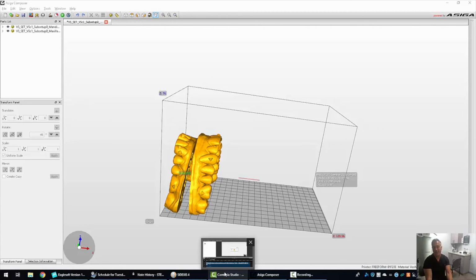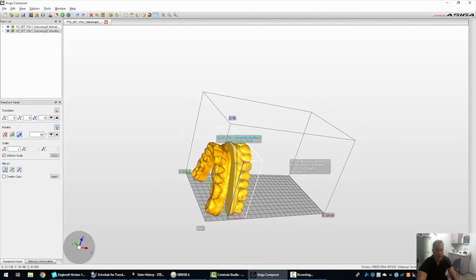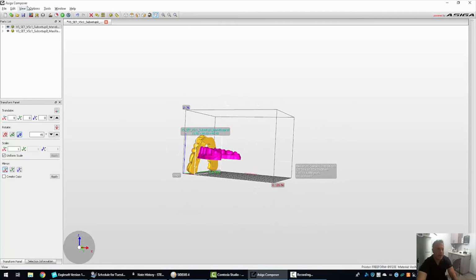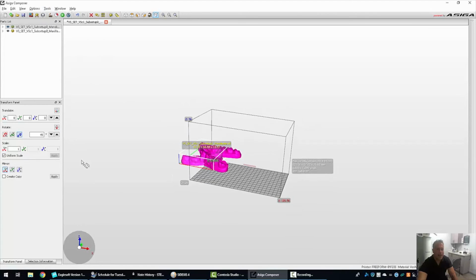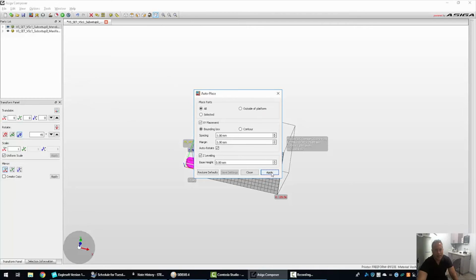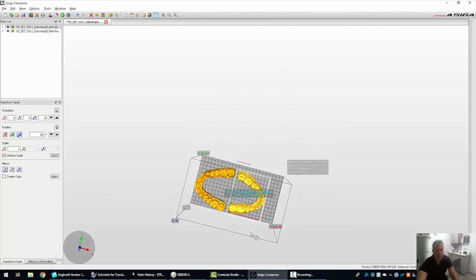Okay, so one thing that we commonly do in dentistry is print models flat on the build plate. Everyone has a different way of doing it. I will say it's a little wonky in the Asiga software. So what you have to do is click the model, come up to Tools, and click on Rotate Facet Downward. And then once you come over here, you can click to make it horizontal. You can do the same over here: Tools, Rotate Facet Downward. And then you have to do an additional step of auto placing them. And then they will go down, and now they're flat on the build plate.